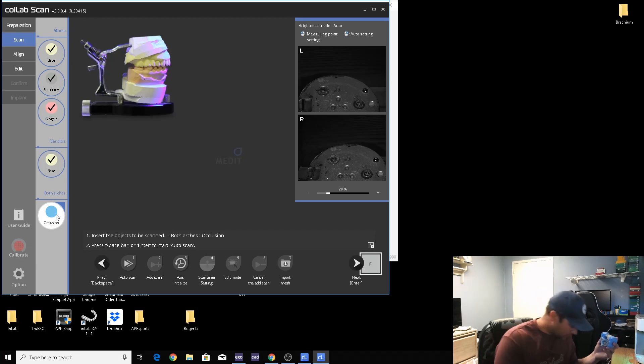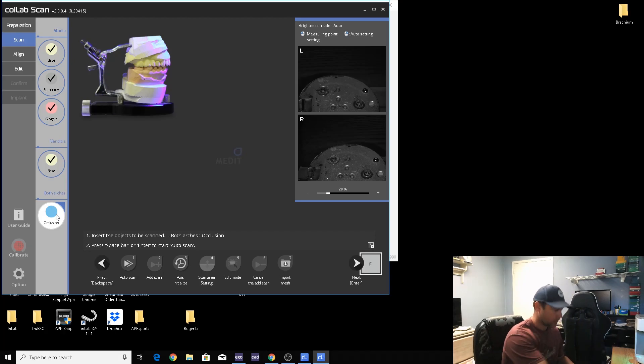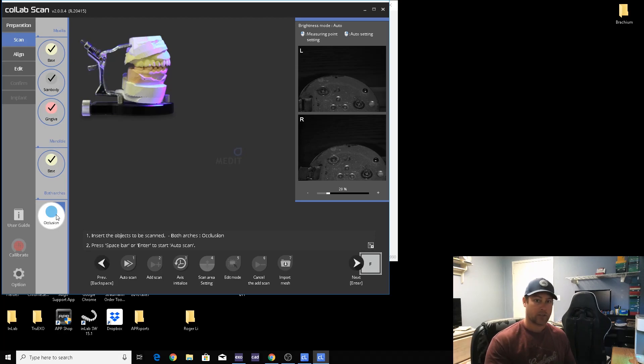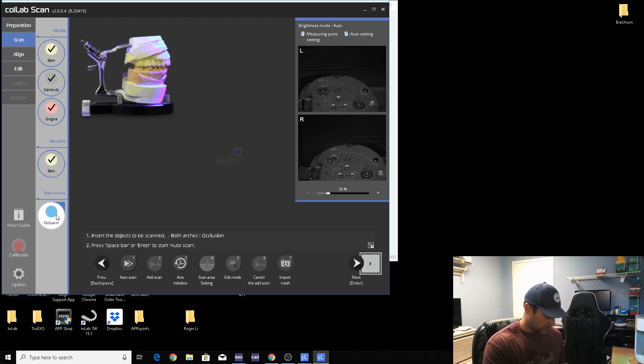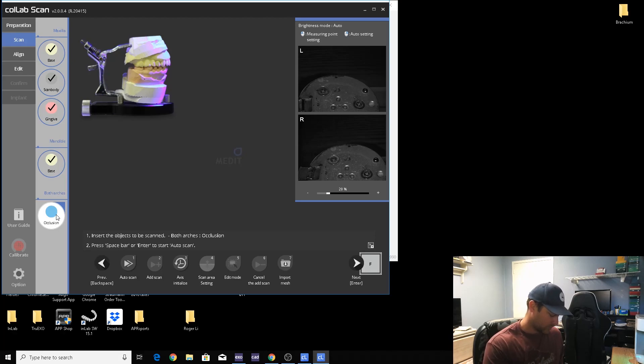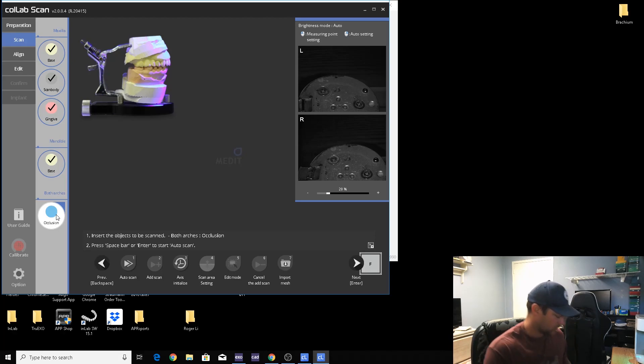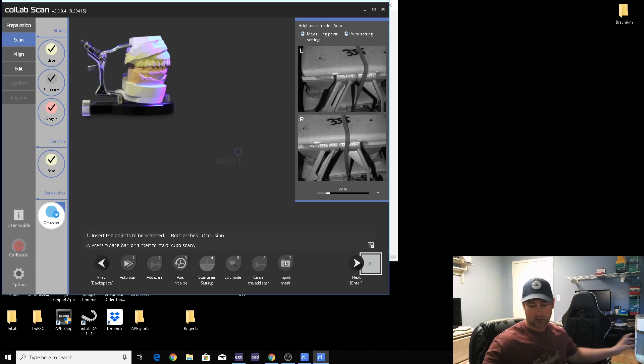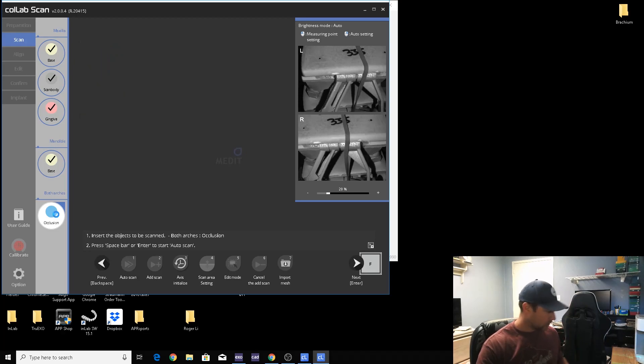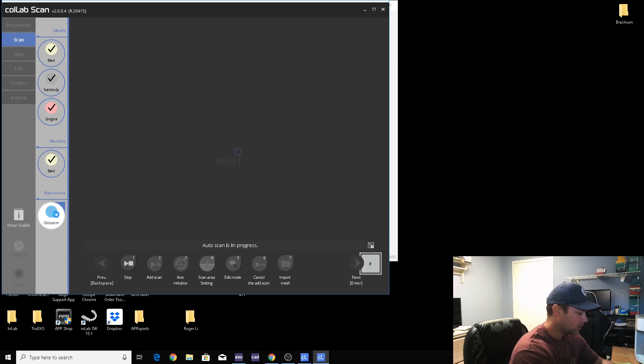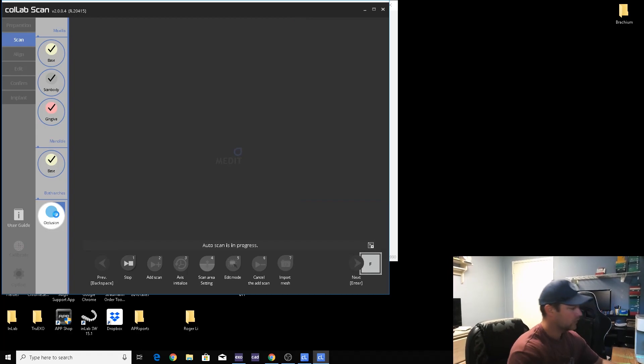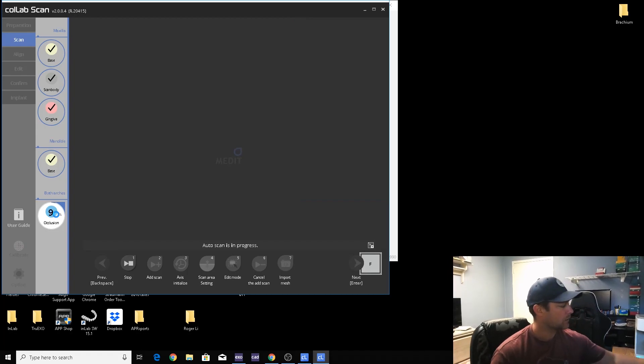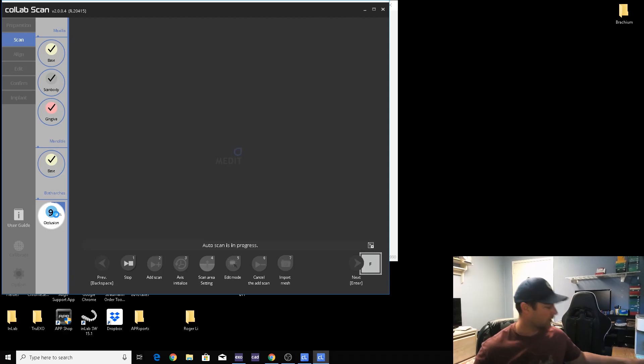I don't know where the band goes. There we go. They always fly around everywhere, never find them. Okay, that's on there. Scan body back in the box so we don't lose them. Back in my tackle box.